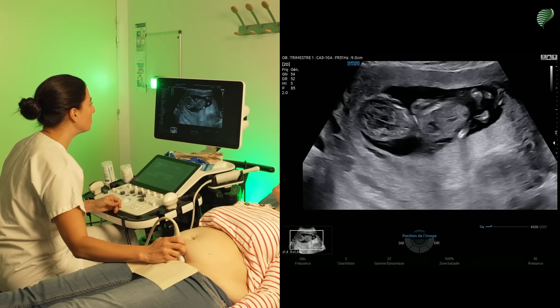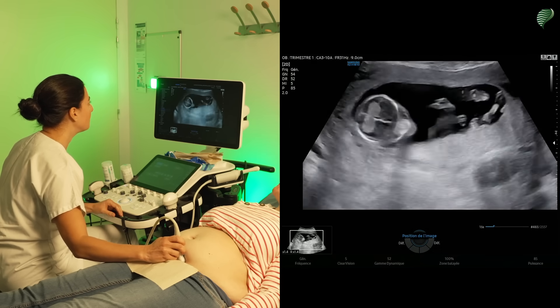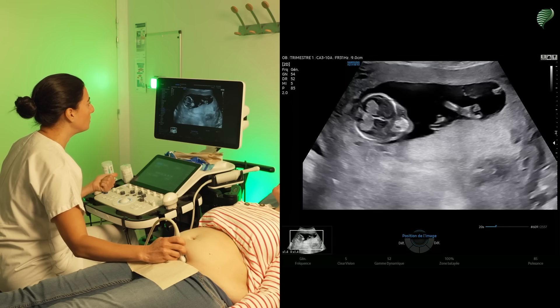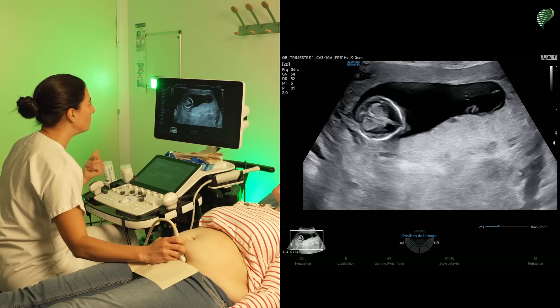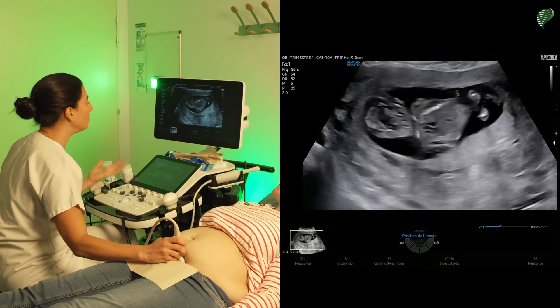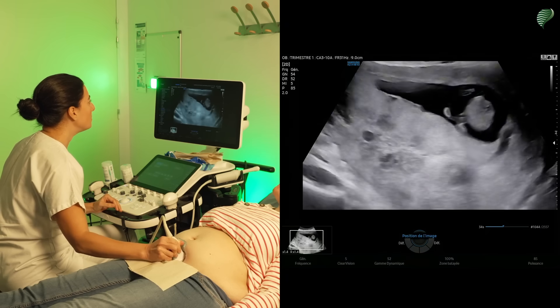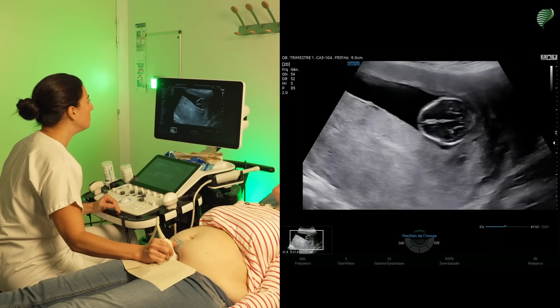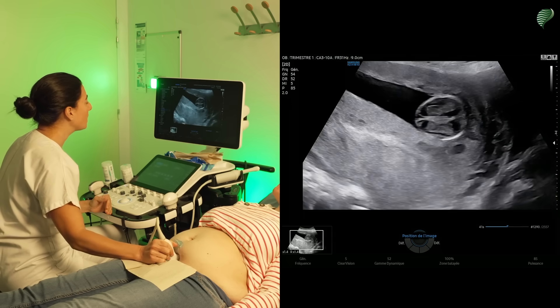Once we've passed this trimester, there is no problem using Doppler. Now I've confirmed there is a pregnancy well located in the uterus, that it's monofetal — there's only one fetus — and that it's progressing well. I will now start my morphological examination, following an order from top to bottom, beginning with the cephalic pole.